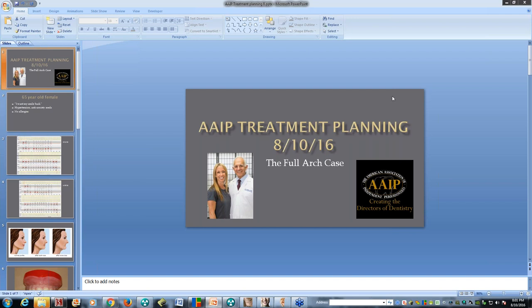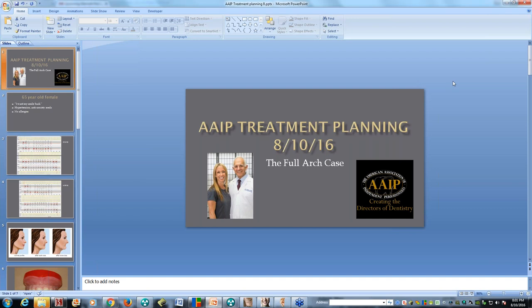Last week we did our webinar on the videos. We started with the new patient phone calls, and the next one will be the doctor call. We're doing this in order of the new patient calling, scheduling, and eventually accepting. Today we're going to be going over a treatment planning session on a full arch case — actually one that we just planned not too long ago.